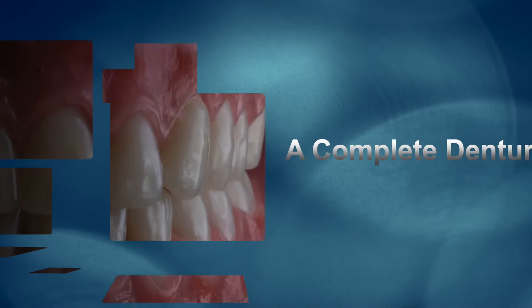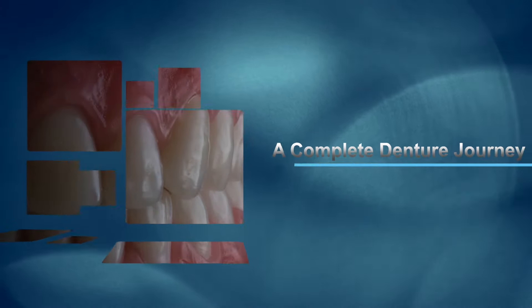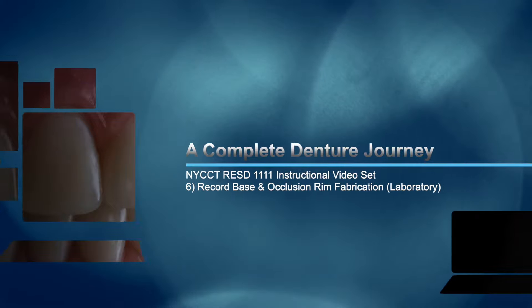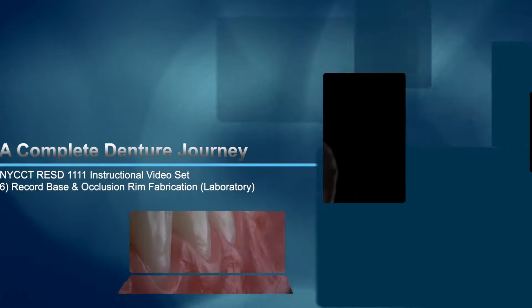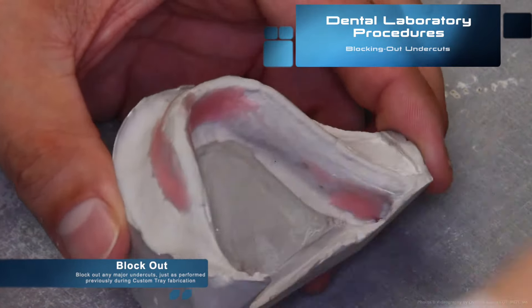Hey everyone and welcome back to a complete denture journey for the New York City College of Technology Department of Restorative Dentistry, complete dentures one course. This video is video number six of the instructional video set. It's on record base and occlusion rim fabrication — this is a laboratory instructional video.